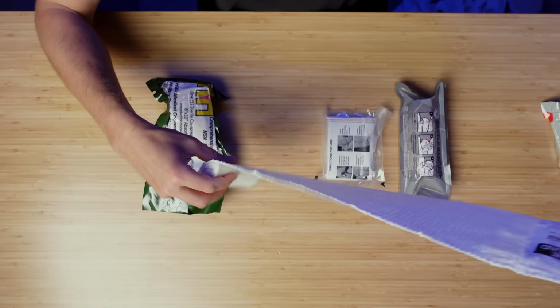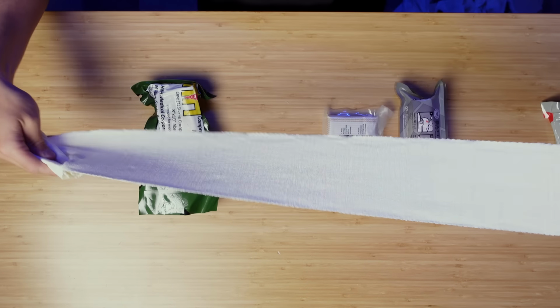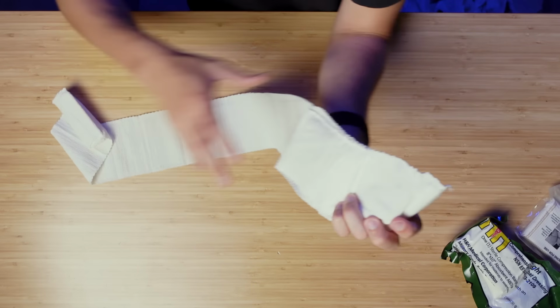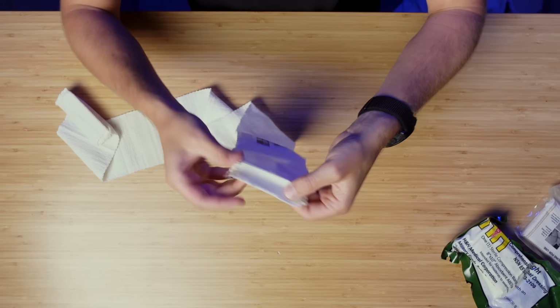Now, some of this gauze has stuff that's going to stop it from unrolling, or some of these bandages have stuff to stop it from unrolling. This one does not. Different models of theirs do. So just be aware that this could go everywhere very quickly. You have this absorbent pad that goes towards the wound. You wrap this and it has Velcro.